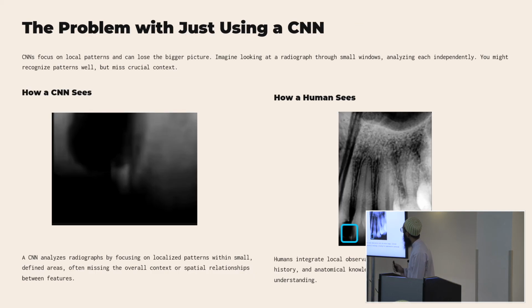Okay, so what Perl uses and what all the dental AI companies use is something called a convolutional neural network. The way it sees is it basically takes a sliding window of a photo and goes over the entire image. In this photo here, obviously there's a huge caries, right?